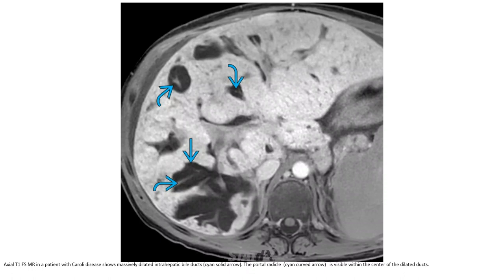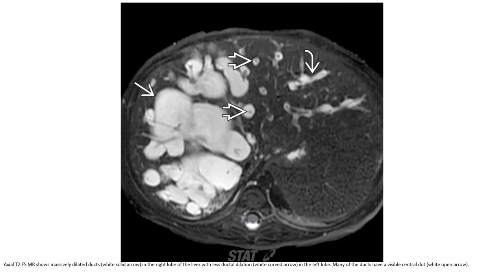MRI in a patient with Caroli disease shows massively dilated intrahepatic bile ducts. The portal radical is visible within the center of the dilated duct. A second MRI sequence shows a massively dilated duct in the right lobe of the liver with less duct dilation in the left lobe. Many of the ducts have a visible central dot.